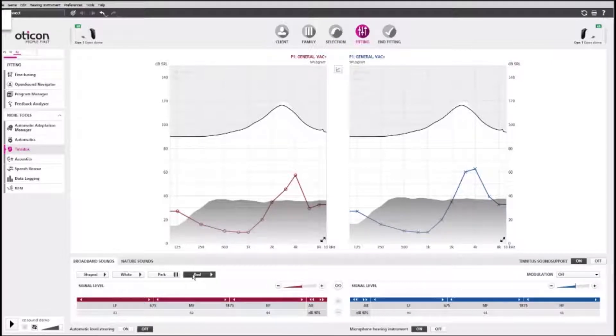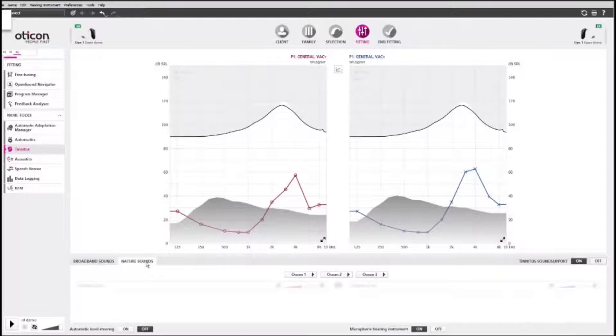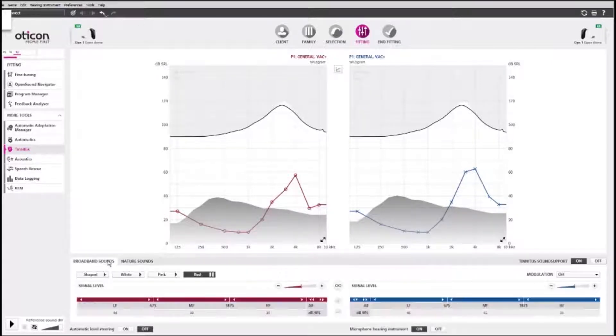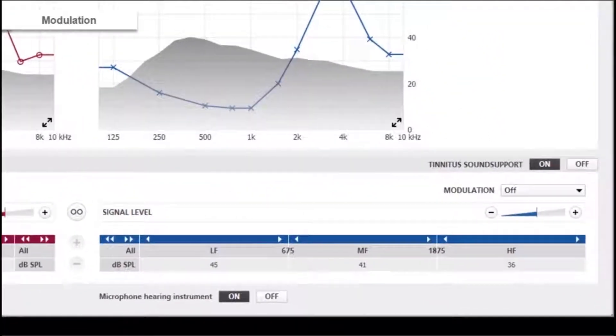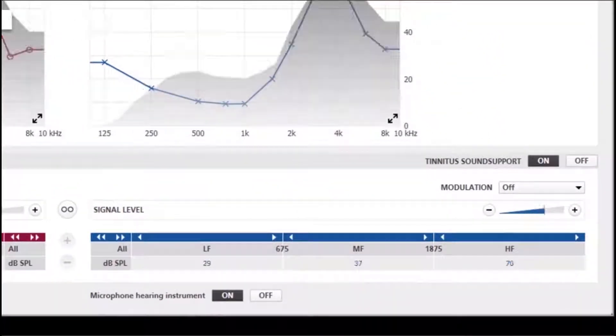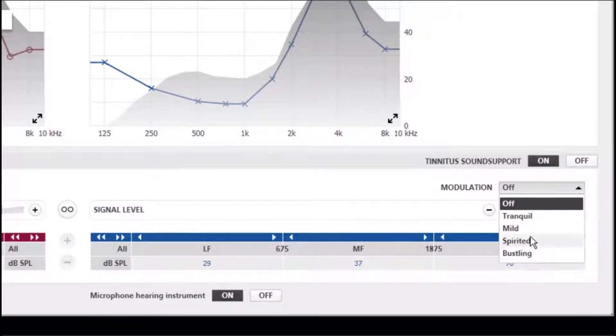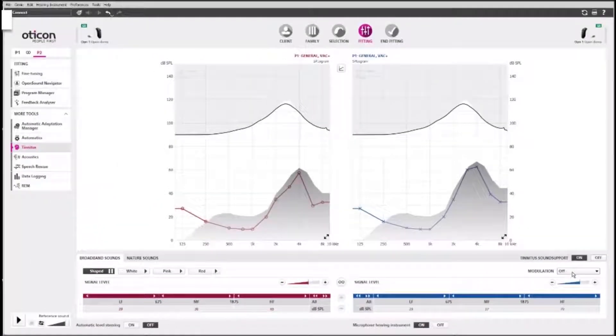White is flat, while pink and red have decreasing spectrums. The Nature Sounds tab gives you access to three relief sounds that mimic the rhythm of the ocean. The modulation feature varies the depth and speed of the broadband sound over time. You can choose between four different modulation settings.